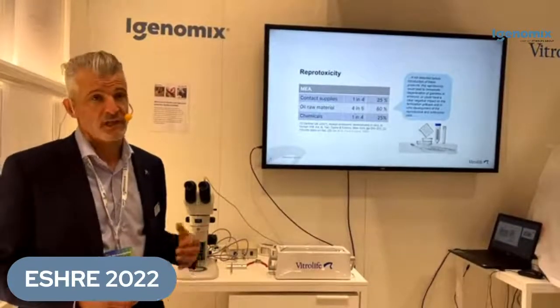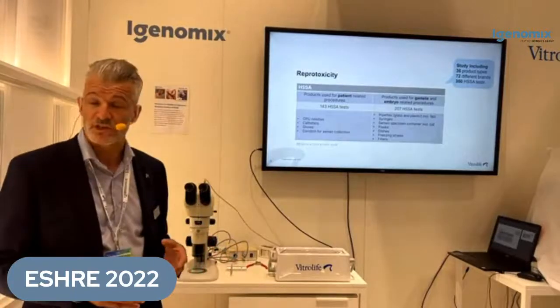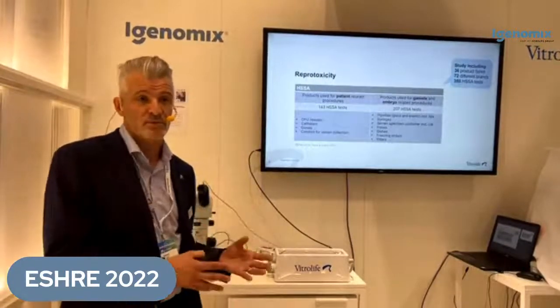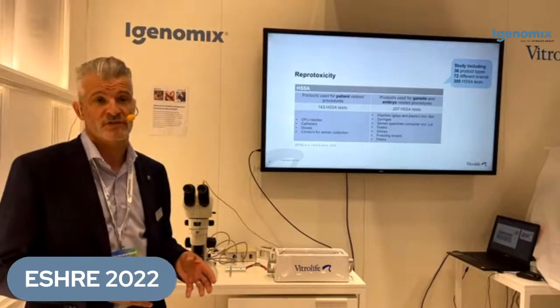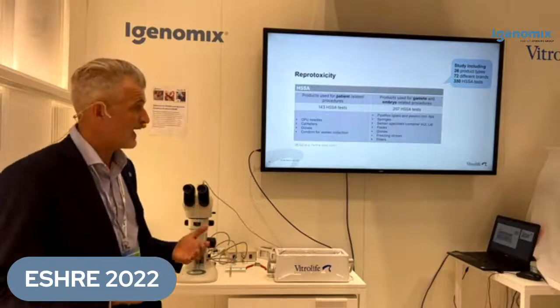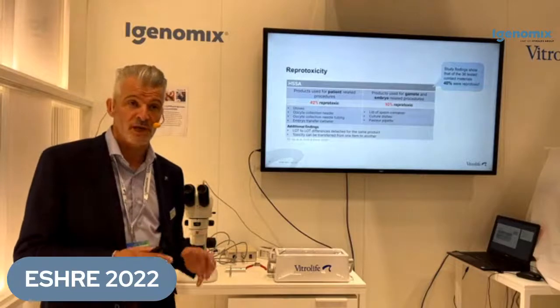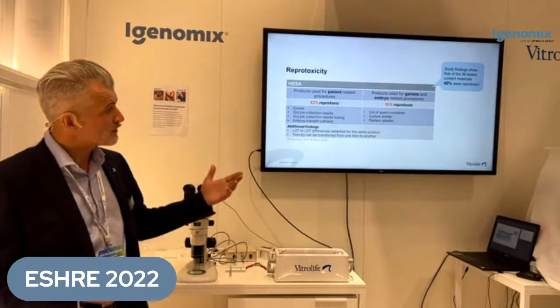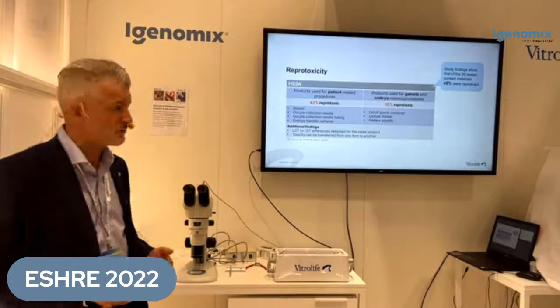And then a further study was carried out in 2019, where they looked at 36 different product types from 72 different brands. They tested these products in terms of patient-related products that were used during the egg collection procedure, for example, gloves, etc. And then they had those products which were classified as direct contact with gametes and embryos. These would cover things such as plasticware, pipettes, and dishes. Using the human sperm survival assay, they found that in those products used for patient-related procedures, almost 42% of these showed reprotoxicity. When they looked at those products which were direct contact with gametes and embryos, they found that 10% of these products were reprotoxic.